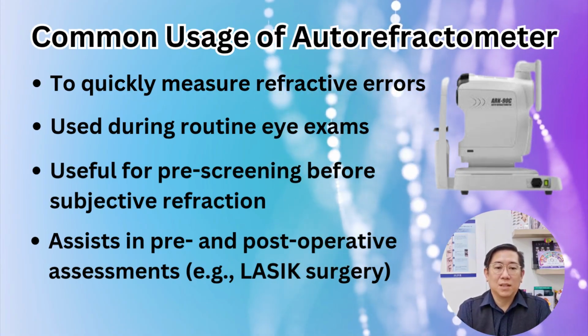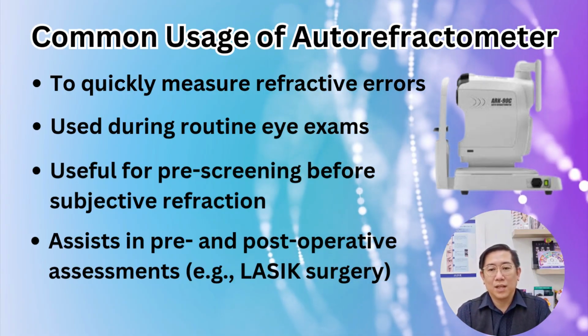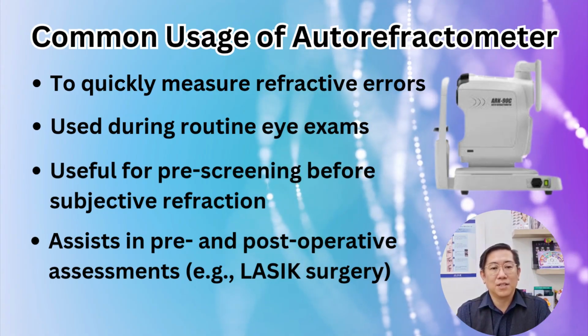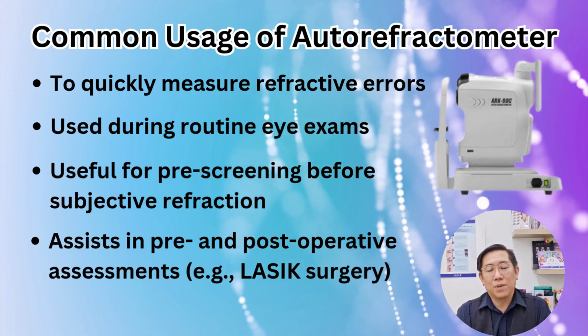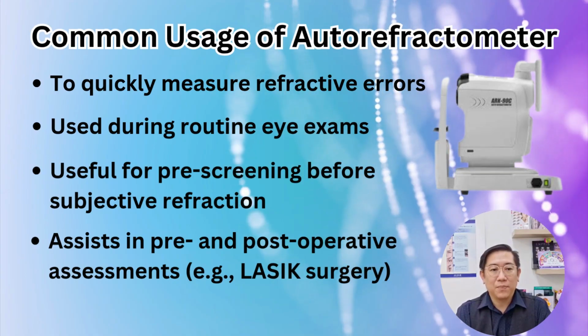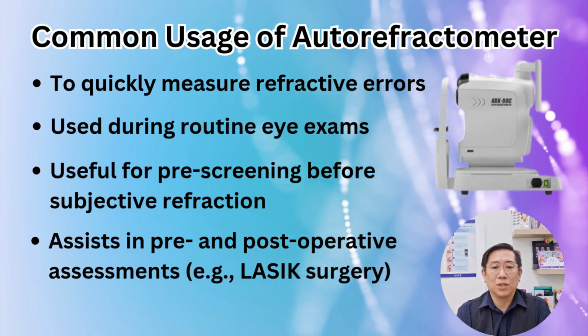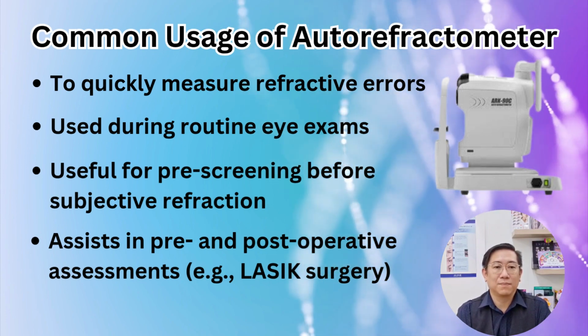But remember this, the autorefractometer is a valuable diagnostic instrument that helps streamline the eye examination process. While it cannot replace a full clinical exam, its speed, objectivity and ease of use make it an essential tool in a modern optometry practice.